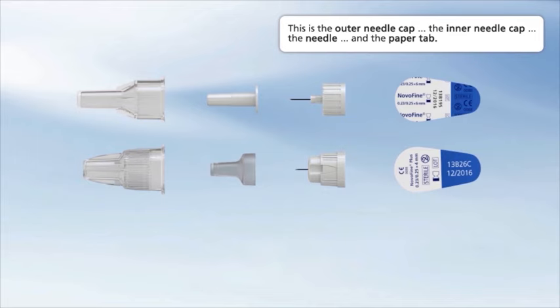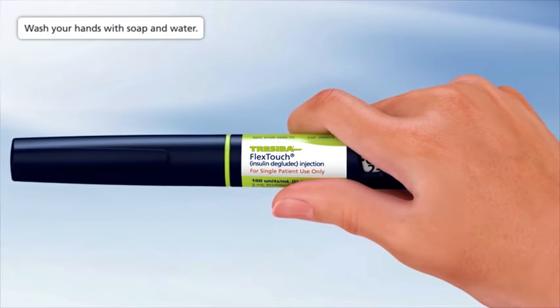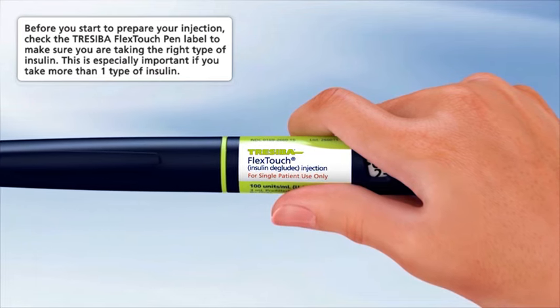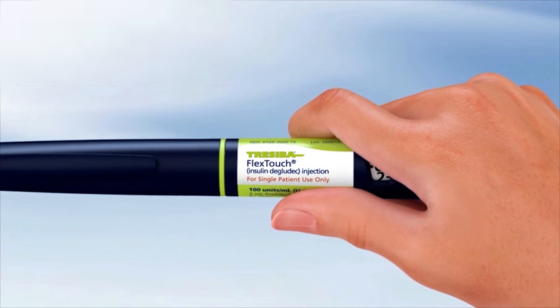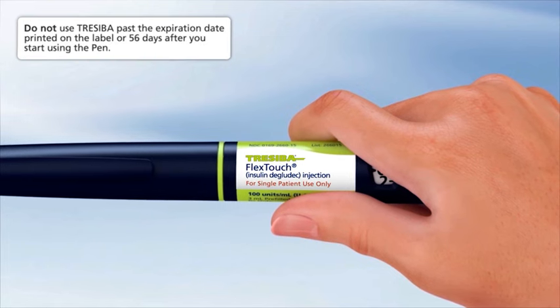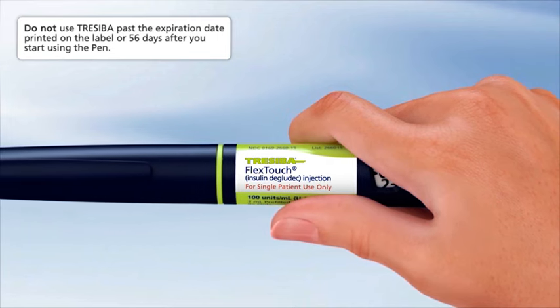Now you are ready to go through the steps for how to inject insulin with your Traceeba FlexTouch Pen. Preparing your Traceeba FlexTouch Pen: wash your hands with soap and water. Before you start to prepare your injection, check the Traceeba FlexTouch Pen label to make sure you are taking the right type of insulin. This is especially important if you take more than one type of insulin. Traceeba should look clear and colorless — do not use it if it is cloudy or colored. Do not use Traceeba past the expiration date printed on the label or 56 days after you start using the pen.